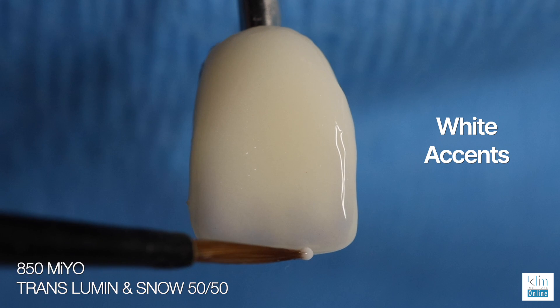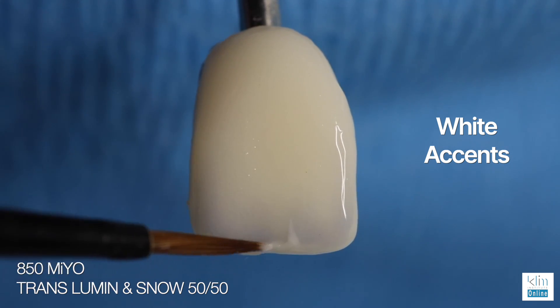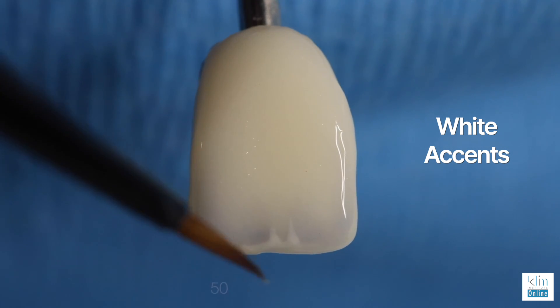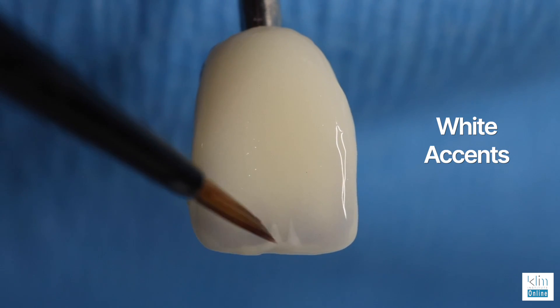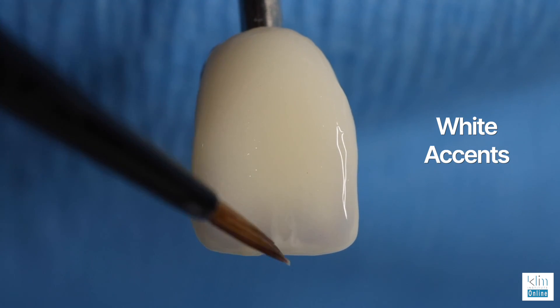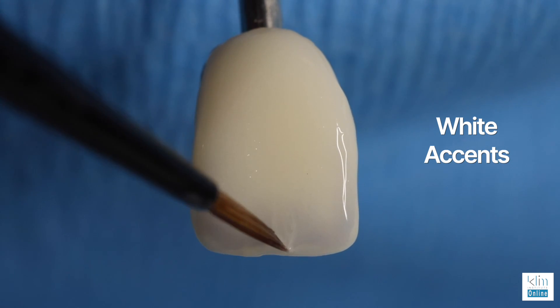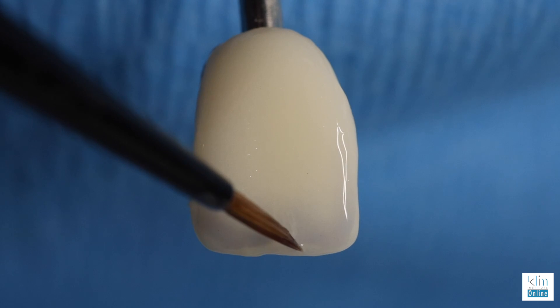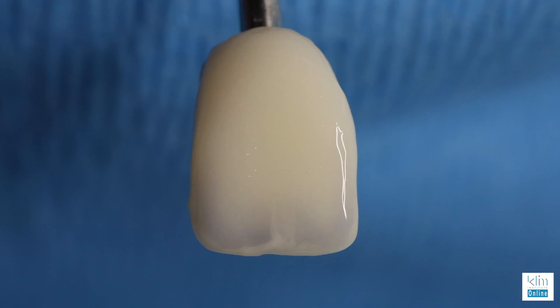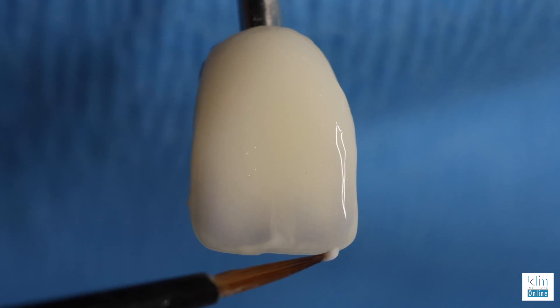White accents — they're fun to do when the case requires it. I like to mix about 50/50 between lumen and snow. Snow is the white and it's pretty intense, so by diluting it with lumen you can play with the incisal edge, float the high value into the halo spring, and move the colors around as you see fit for the case. Now take a look at the contrast with the low value — this is what makes a restoration come alive.